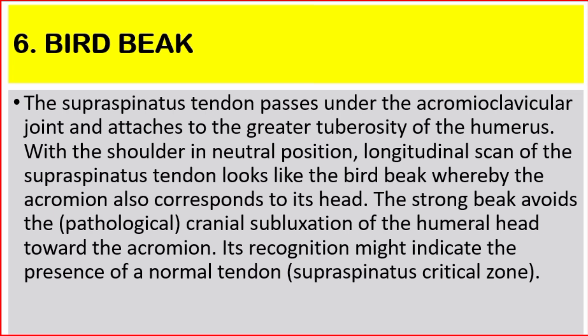Number six: bird beak. The supraspinatus tendon passes under the acromioclavicular joint and attaches to the greater tuberosity of the humerus. With the shoulder in neutral position, longitudinal scan of the supraspinatus tendon looks like a bird beak, whereby the acromion corresponds to its head. The strong beak avoids the pathological cranial subluxation of the humeral head towards the acromion. Its recognition might indicate the presence of a normal supraspinatus tendon critical zone.